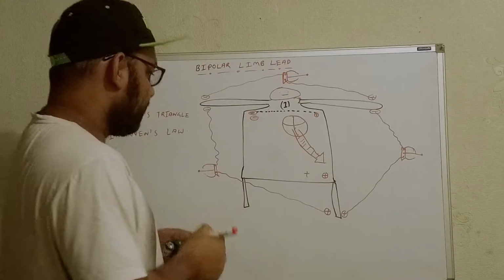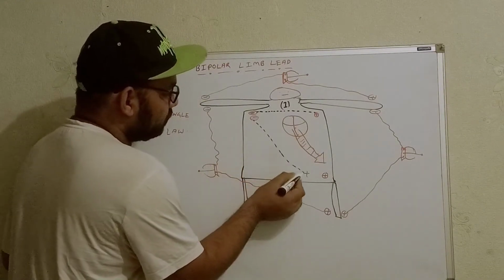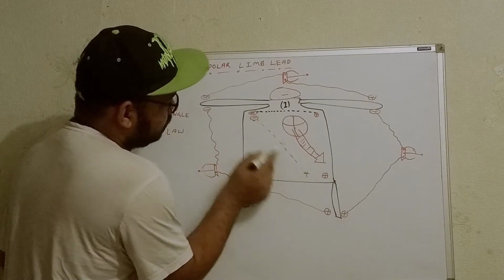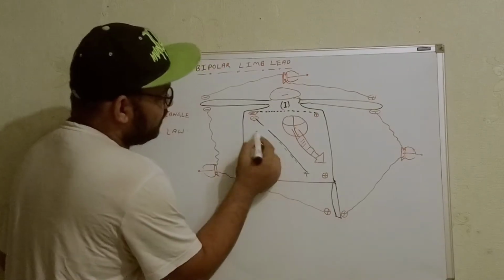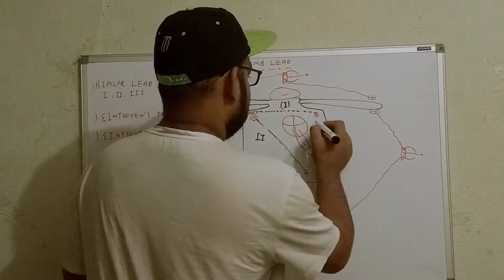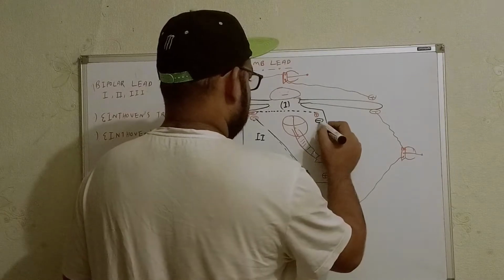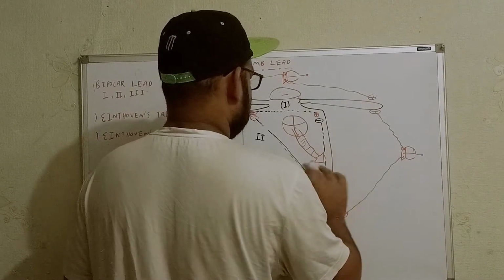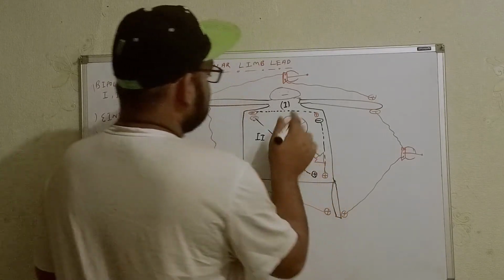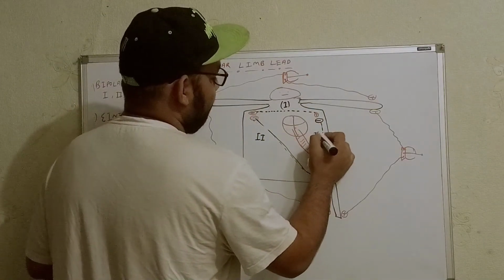In the same way, we'll get lead number 2 whenever we connect these two. Let's make it more clear. The axis will give lead number 2 over here, and we'll also get one negative over here and one more positive, and another one this one. Let's make the positive a little bit closer. Now we have the three sets: lead number 1, lead number 2, and lead number 3.